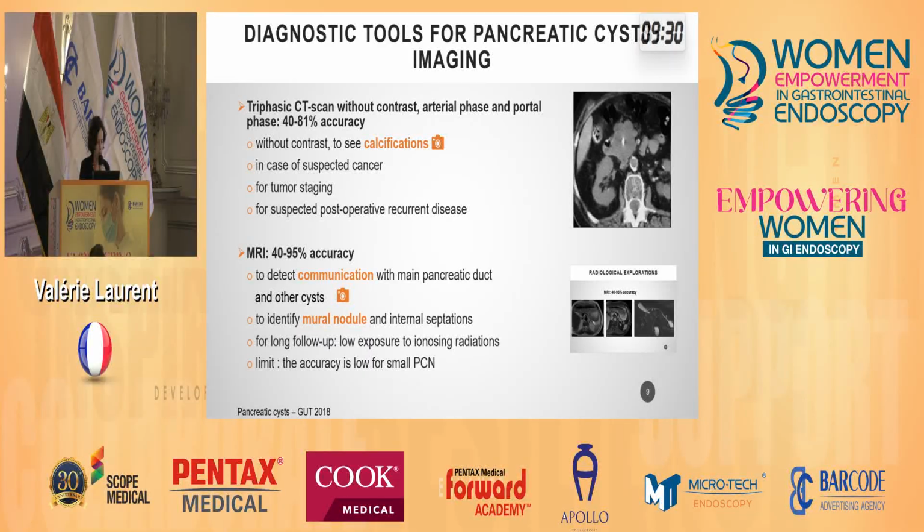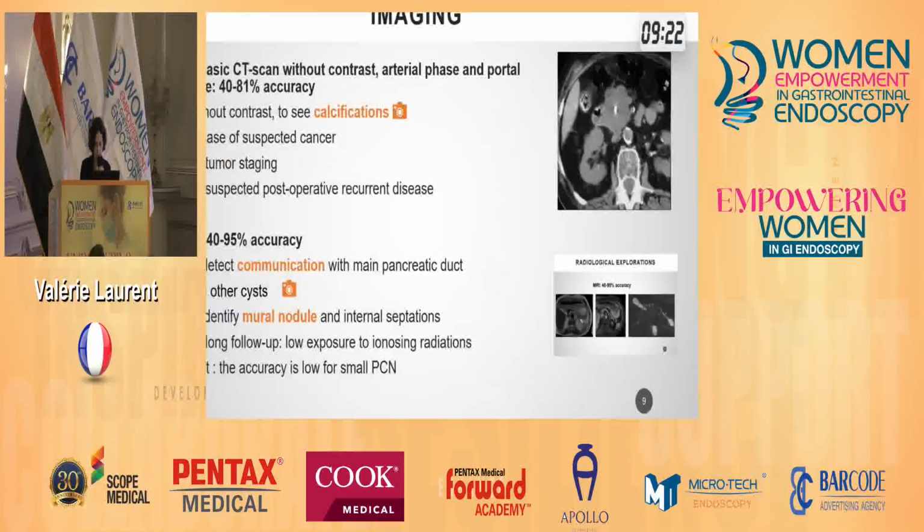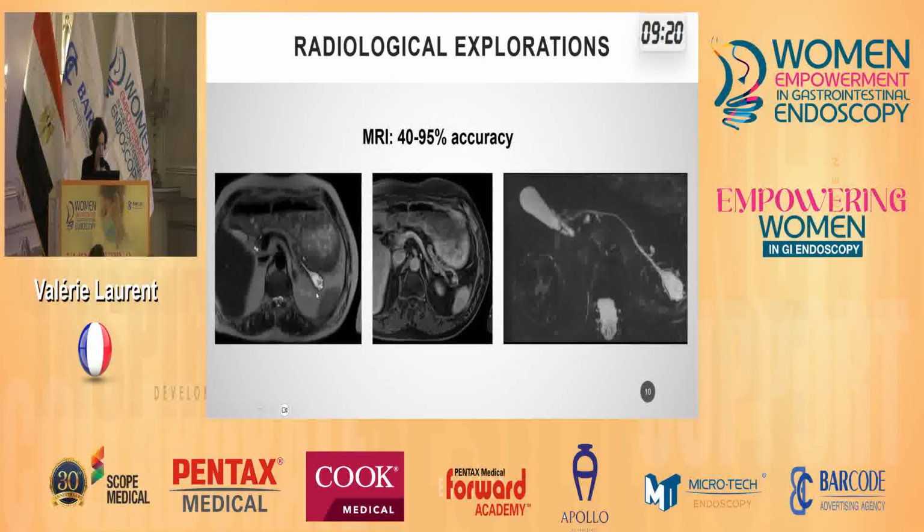It is able to detect communication with the main pancreatic duct very well and to identify mural nodules, as you can see in this example. And it's very interesting for the patient to avoid radiation exposure.